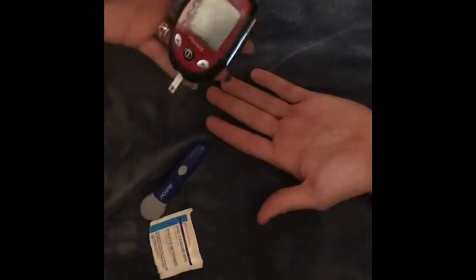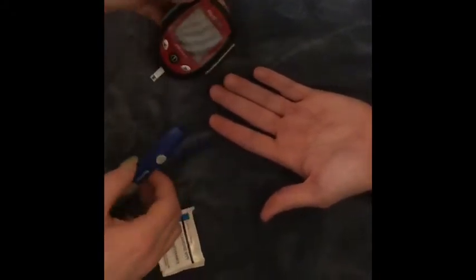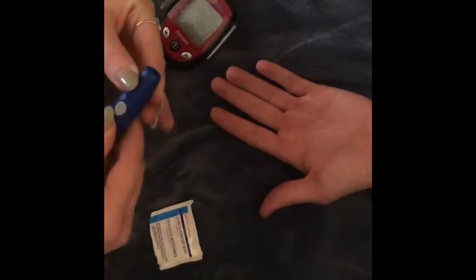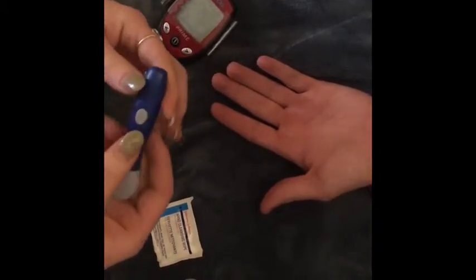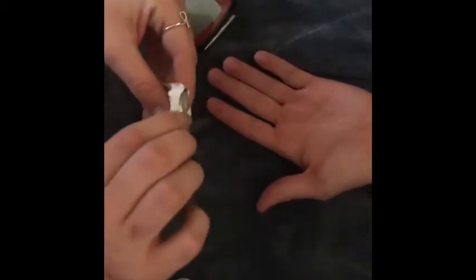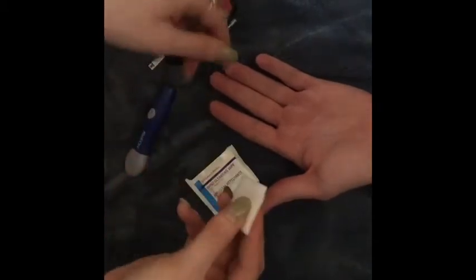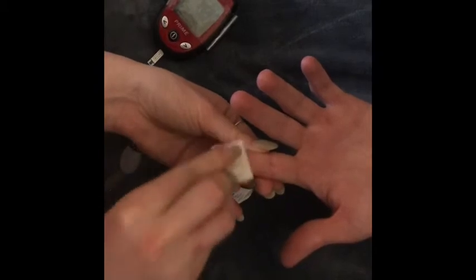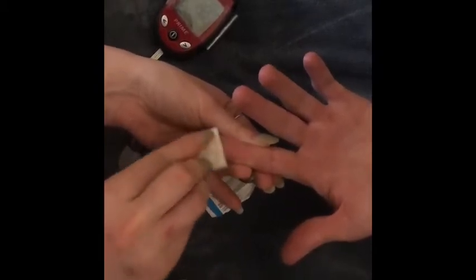The machine indicates that you're going to need blood. You'll have a lancet device like this. First, use an alcohol prep pad to wipe down the finger — we're going to use this index finger.